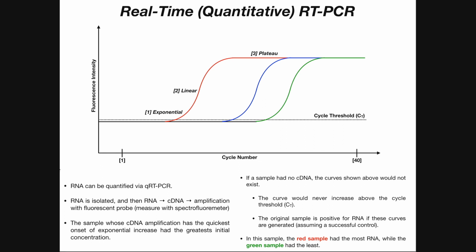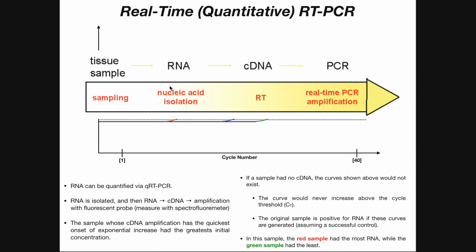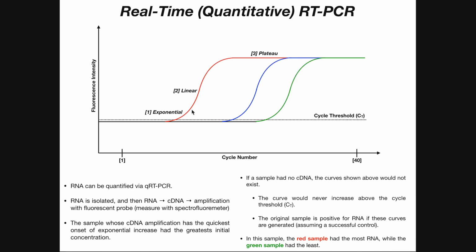They're taking a sample, they're isolating viral RNA, if there's viral RNA present, and they're converting that viral RNA into corresponding DNA through reverse transcription, and then they're measuring the fluorescence via this PCR amplification process, and they're looking to see if they get this increase in fluorescence, and if they do, that possibly means that they've got an infection of the coronavirus.